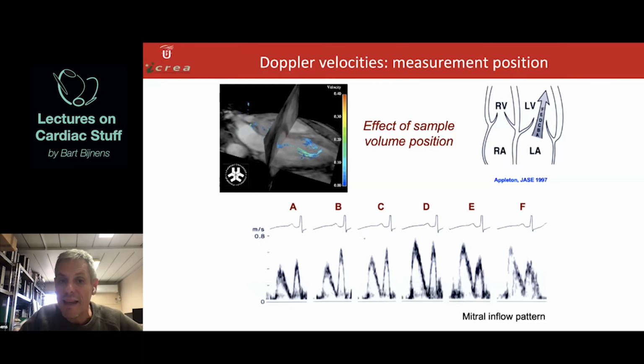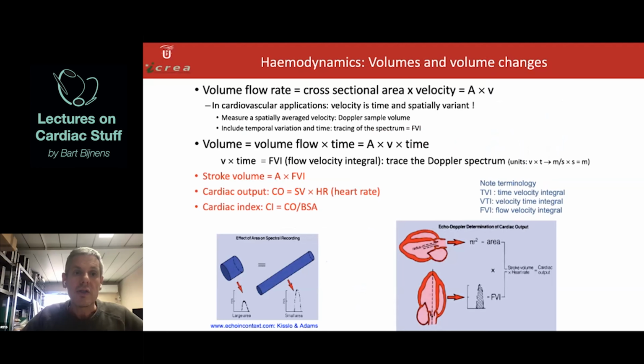And what some people are saying, and that's what's been done in the past, unfortunately not anymore too much, is that you should measure at different positions. And then depending on which component you're looking at, you want to use different data. Here again, if we had a full 3D, 4D acquisition of the velocity vector over time at a high spatial and temporal resolution, we could partially avoid this by really tracking. But currently in clinical practice, we don't have that. So this is another source of variability, of course, of the shape.